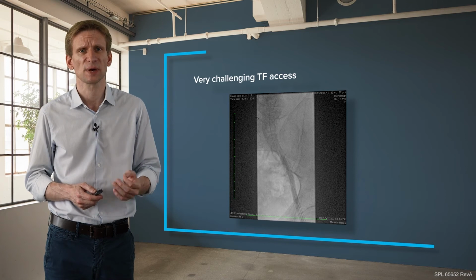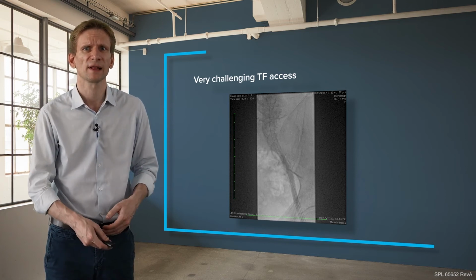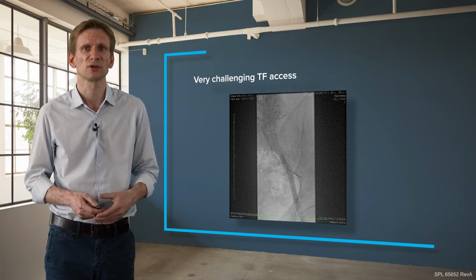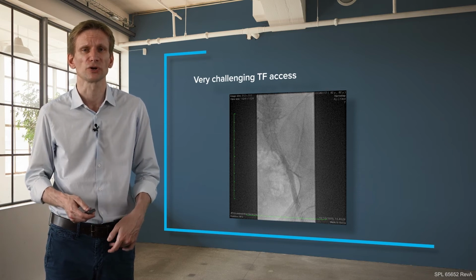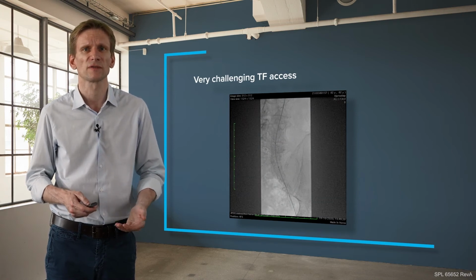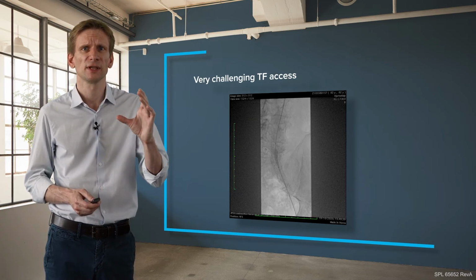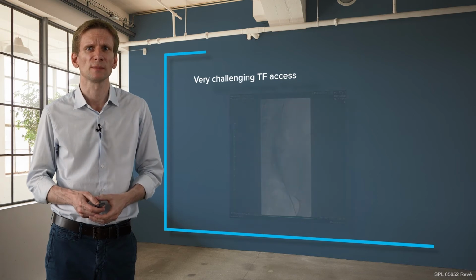Again, of course, especially in this case, I have a safety wire crossed over from the right to the left leg, and especially crossing over also the insertion place, because I anticipate maybe I will not have a successful closure of my access site, but then I anticipate I can either use a balloon or a covered stent. But as said, again, for my IVL treated part, I'm not too concerned. I have a very nice expansion and treatment here with my IVL catheter.